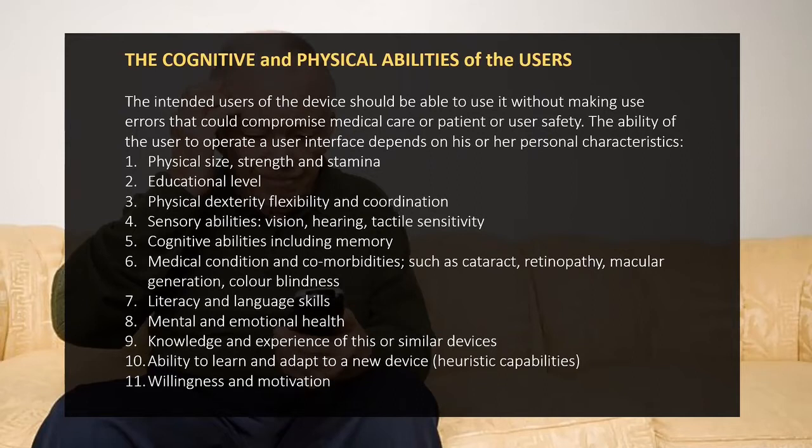This is a little bit strange, but often people interacting with a medical device feel terrible, not resent, but they feel a burden, which is reinforcing their disability, their infirmity.